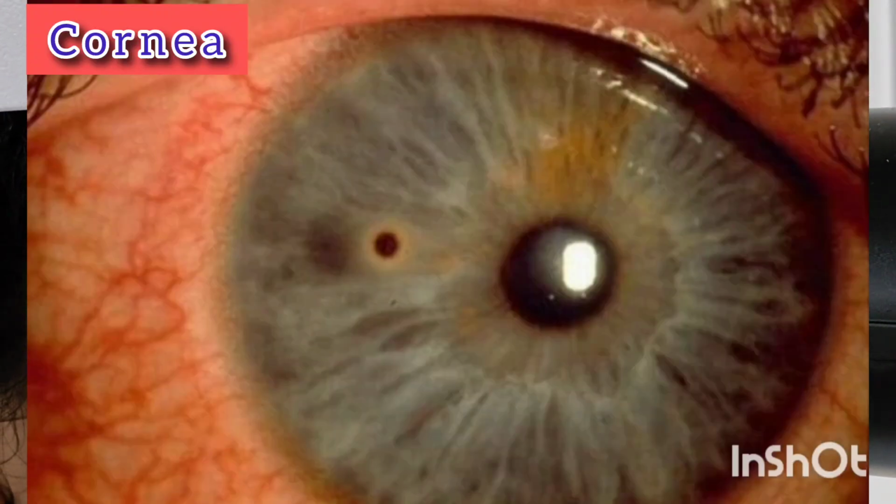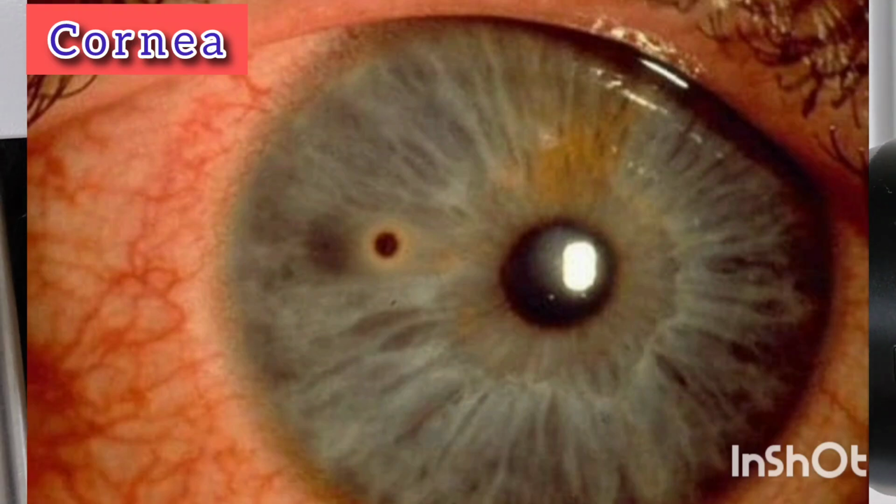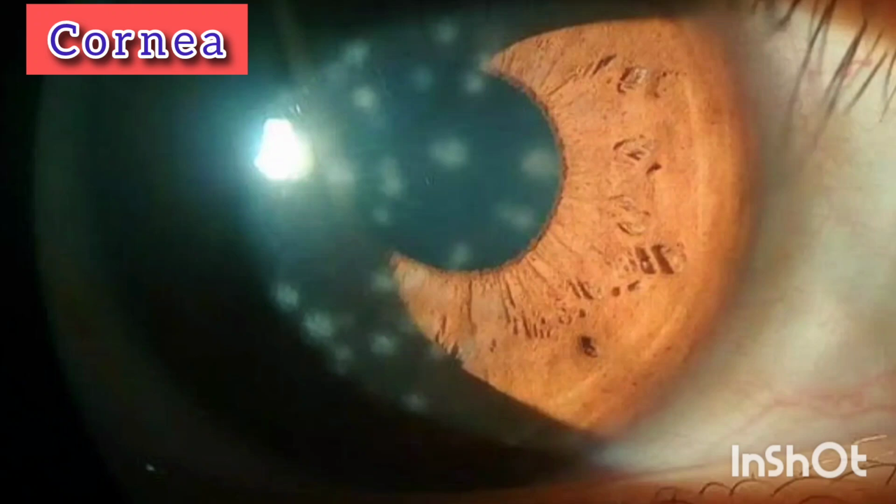To check foreign body, direct and diffuse illumination can be used. Examine the superficial layer of the cornea for SPKs or any corneal opacity.